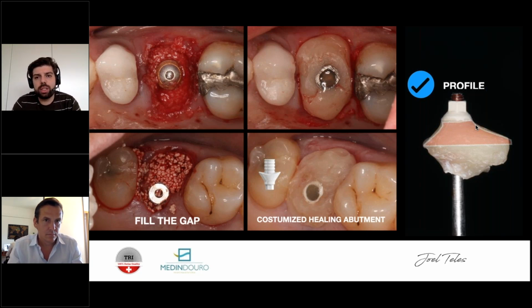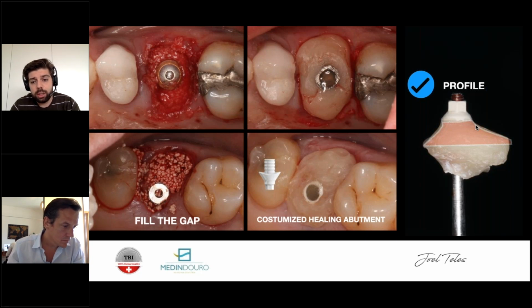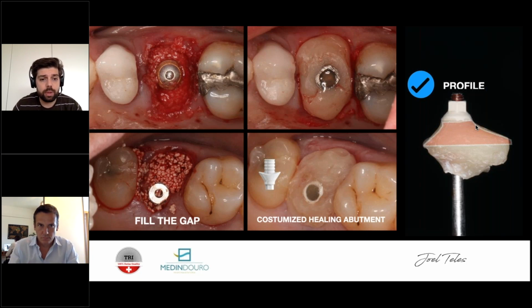The sealing of the socket is done with a healing abutment alone, nothing more. And also, I don't use stitches in this scenario. If the tissue is unharmed, I will not use sutures. It's left exactly like this, and it's the healing abutment that is sealing the socket and keeping the tissues in place. This is very, very easy, very predictable, with really good results. The thing is that you need primary stability to do it, so it depends a lot on the way you extract your tooth, the conditions of the fresh socket itself, and of course, again, on the amount of bone.